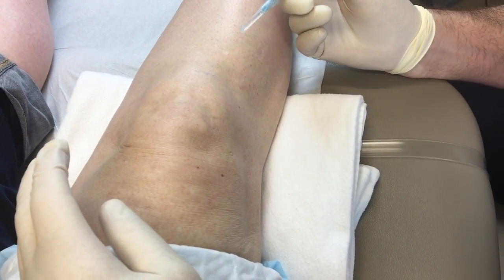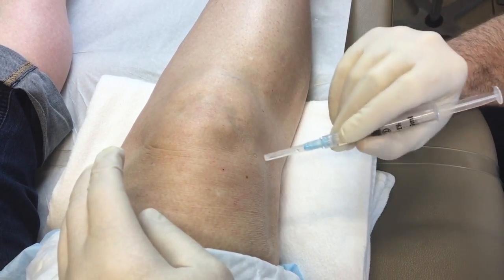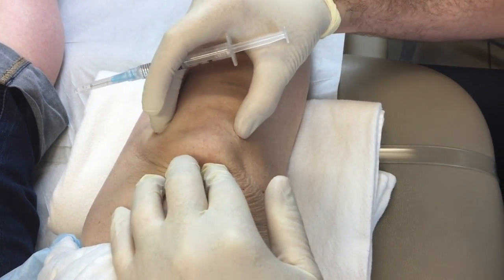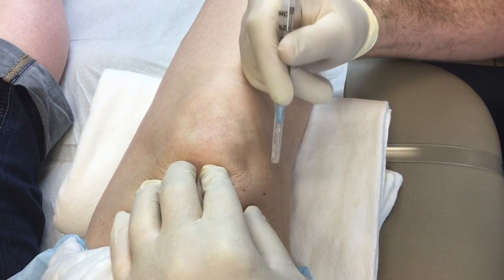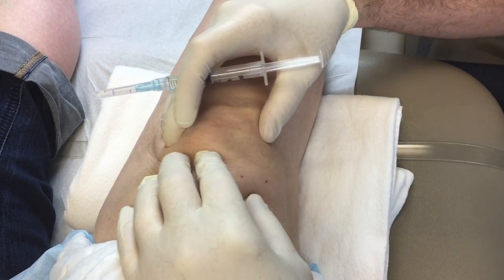You can do these injections a variety of ways. The most common is the lateral retropatellar injection, which is the one we're going to be doing here. I've marked a spot on her knee. When landmarking this, you're going to look for the superior apex of the patella and the lateral border. It forms a triangle, and at its apex you inject horizontally, a little bit medially and inferiorly into the knee.